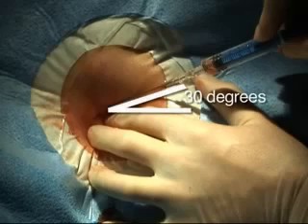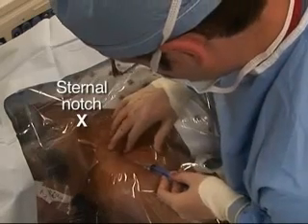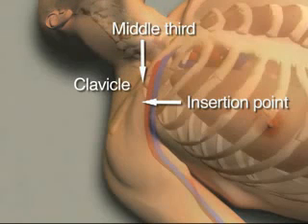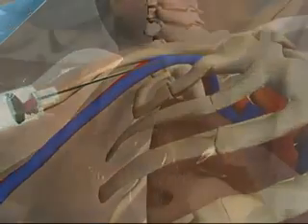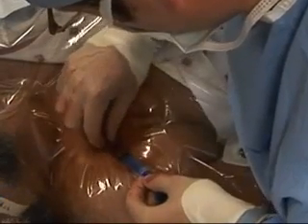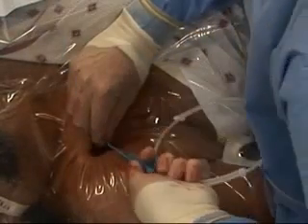Using the insertion needle, approach the site at a 30 degree angle to the skin with the long axis of the needle directed toward the sternal notch. Puncture the skin just lateral to the middle third of the clavicle. Continue to aim toward the sternal notch with the needle tracking just beneath the clavicle, avoiding penetration into the deep tissues of the neck. Typically, the vein is accessed immediately beneath the clavicle, although needle penetration under the skin may reach several centimeters.